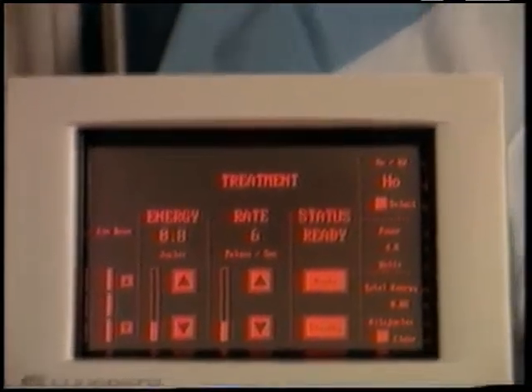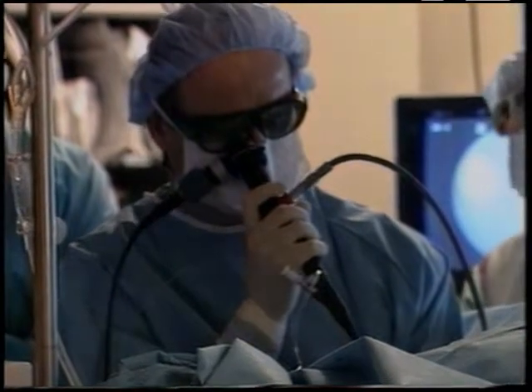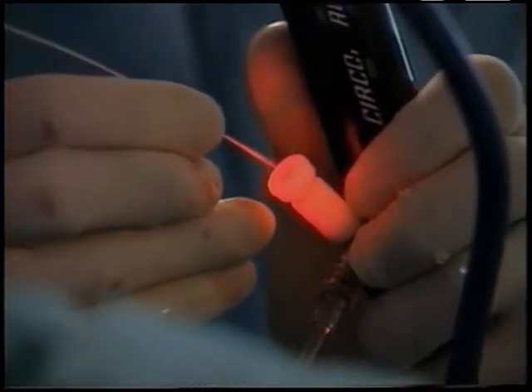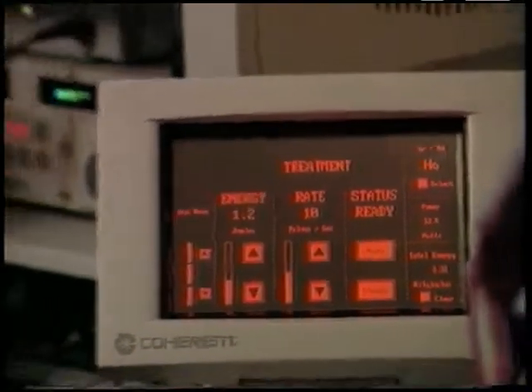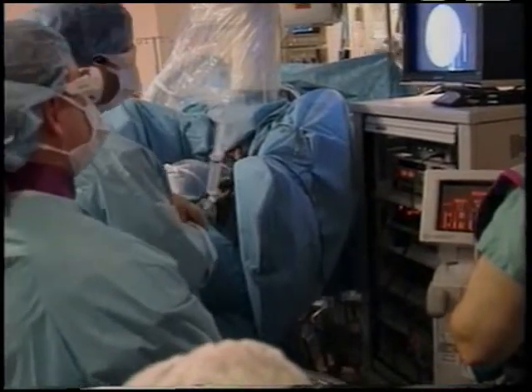The Holmium laser is effective for two of the most common endoscopic applications in urology. These are the fragmentation of calculi and the incision or ablation of tissue. The Holmium YAG laser produces light at a frequency of 2100 nanometers, which can be carried by high-quality, low-water content quartz fibers. The energy is absorbed by tissue with penetration of less than 1/2 millimeter. This results in very well-defined tissue effects for either ablation or cutting. In addition, all types of calculi are efficiently fragmented by the Holmium laser.